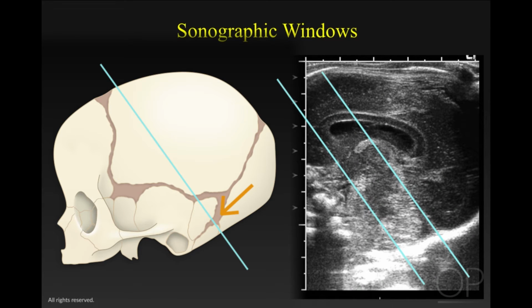The workhorse for us is the mastoid fontanelle. We have included this view in our standard sonography on all but very few cases at our institution. The mastoid fontanelle is located at the junction of the parietal, the temporal, and the occipital bone. The external landmarks for it are located 1 centimeter behind the tragus of the ear and between 1/2 and 1 centimeter superior to that line.